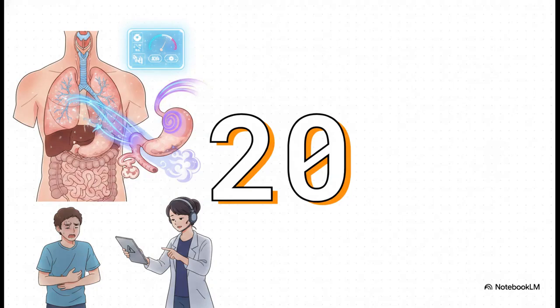So the crucial point here, a massive clinical pearl to remember, is the number 20. When you're aggressively titrating that IPAP upward to get a larger tidal volume, you generally need to keep your maximum IPAP under 20 centimeters of water. And the reason for this is pure anatomy. Your patient's lower esophageal sphincter tone sits right around 23 to 25 centimeters of water. If your inspiratory pressure exceeds that tone, you are going to blow right past the sphincter, fill the patient's stomach with air, cause massive gastric distension, and drastically increase their risk of vomiting and aspiration.